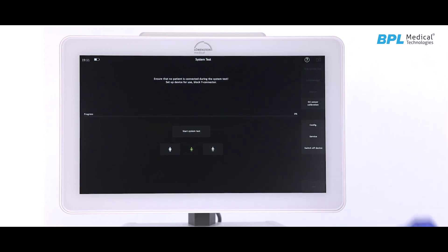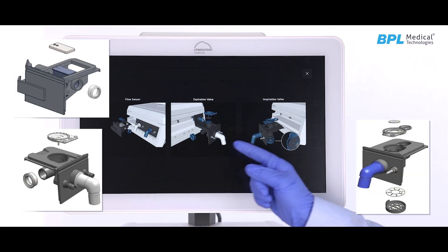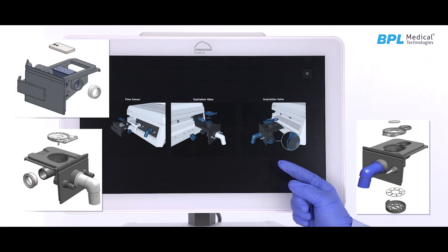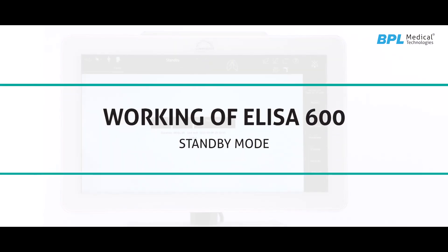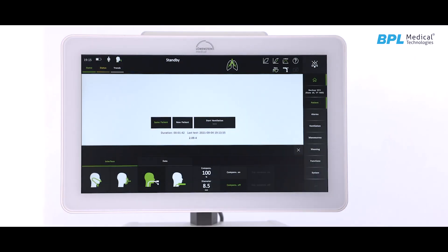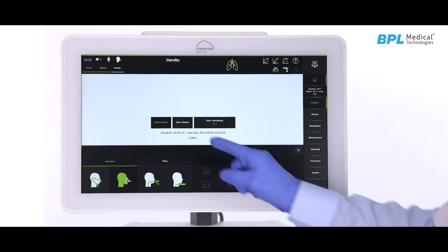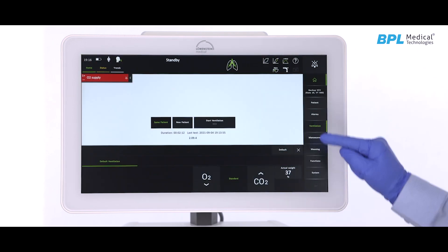A detailed pictorial representation of the inspiratory and expiratory valve or sensor assembly is provided. After completing all the tests, the user will enter standby mode, where the following options are available: type of ventilation, new patient with ideal body weight calculator, and ventilation mode.